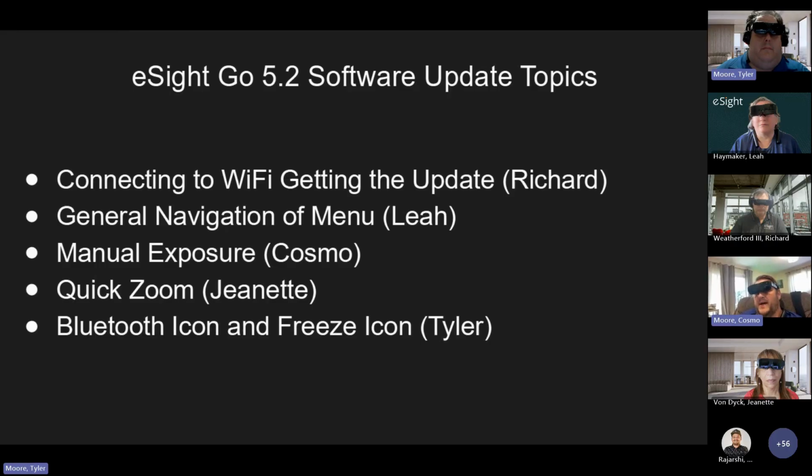And it's just a nice option. If I'm looking at my email on my iPad, the white background with the text on it can be a little bit bright and kind of wash out some of the letters, make it a little fuzzy. Lowering the exposure is an easy way to adjust it. You could also just turn down the brightness on your screen, and that's easy enough on an iPad or an iPhone, not as easy on a television.